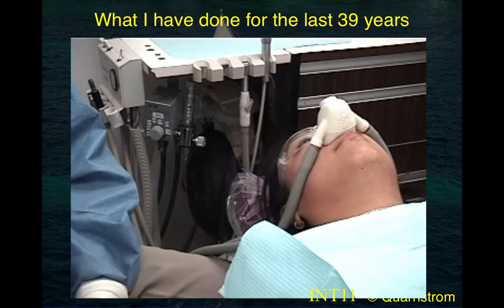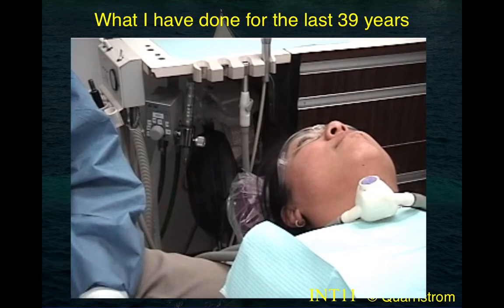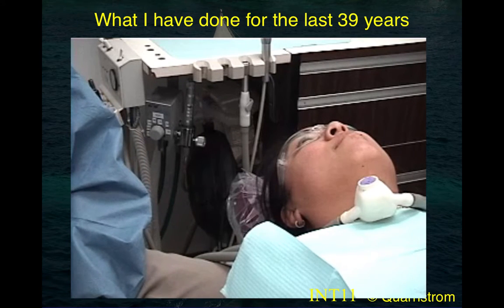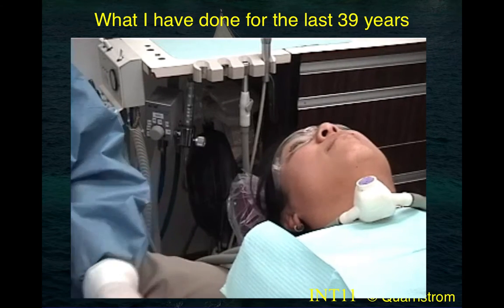But when you leave the room, I strongly believe the nitrous oxide mask should be off, and that way you don't have to worry about someone deciding to get up and they're under the effects of the sedation, trip and stumble, injure themselves. If they're in the room on nitrous, they need to have, at a bare minimum, a dental assistant in the room monitoring them to be sure that they haven't gone to sleep. How do you know if they're asleep? You ask them, how you doing? Are you awake?